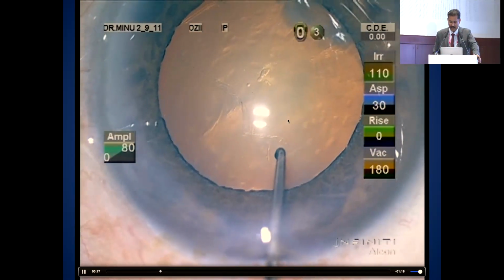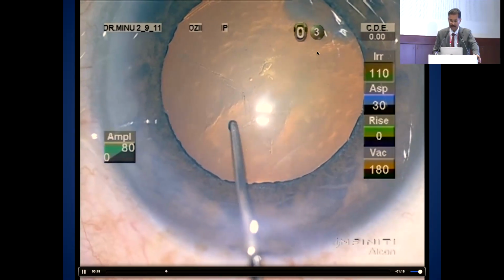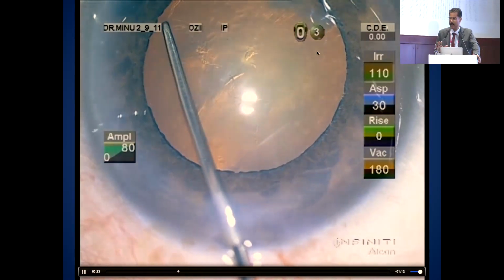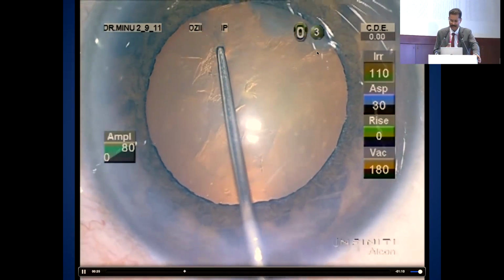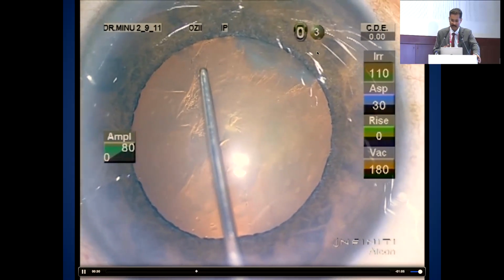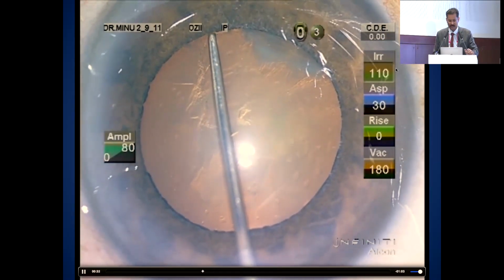But then you see this kind of exfoliated anterior capsule, so don't take it as something else. It may be there, so it can be just ignored. You can just go through that and complete the capsular rhexis. You don't have to. This is just for demonstration sake.